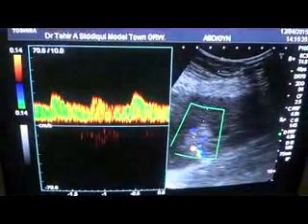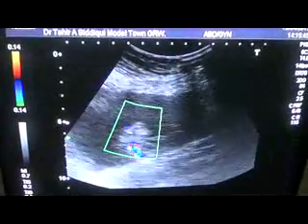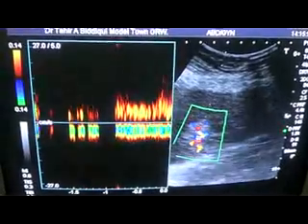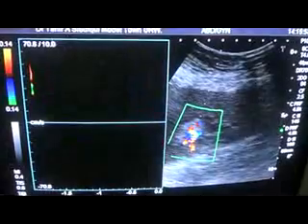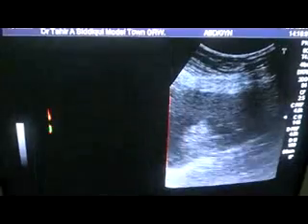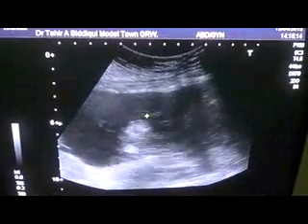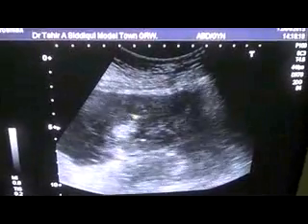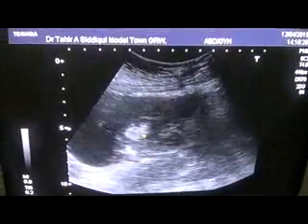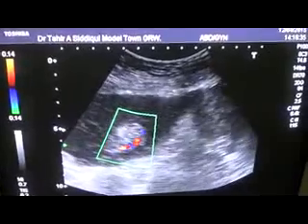This is the arterial flow and this is the venous flow. This echogenic area is not simple — it has blood flow within it and is surrounded by fluid that contains debris as well as thick and thin septas. These are linear thread-like structures of the septa — septated fluid in the region of the right adnexa, once again showing the vascularity of this echogenic area.